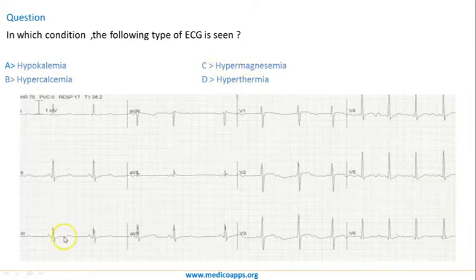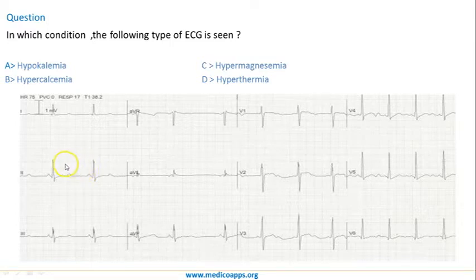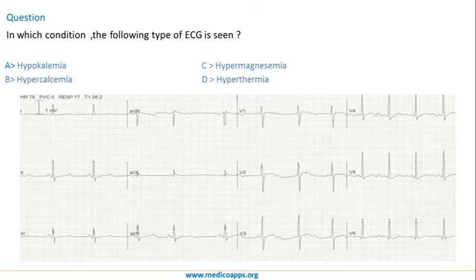Let's look at the rate. Counting 1, 2, 3, 4, almost 5 large squares. Five large squares means it's a rate of around 60 beats per minute — 300 divided by 5 is 60 beats per minute.